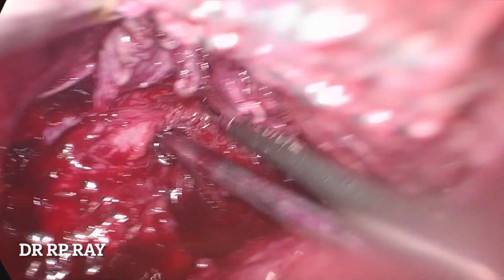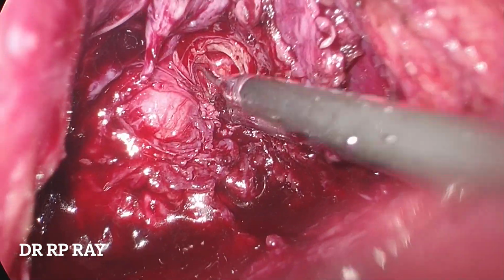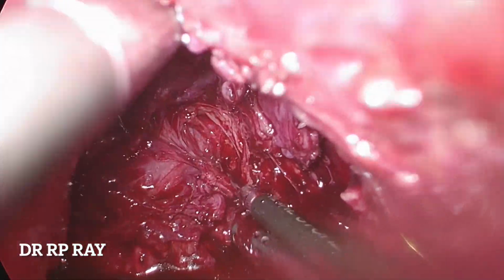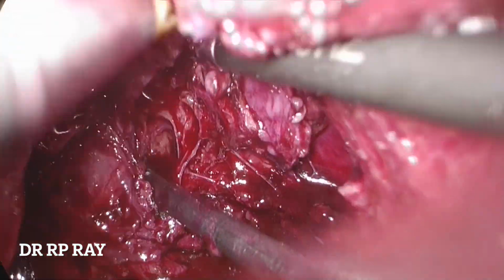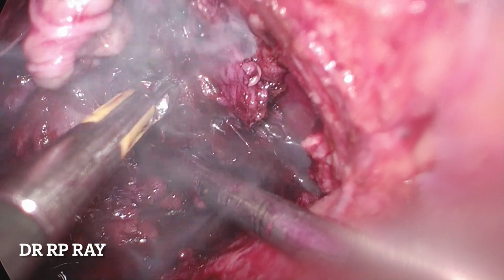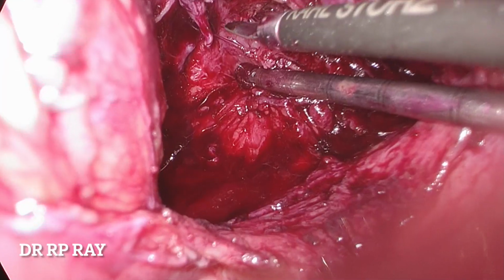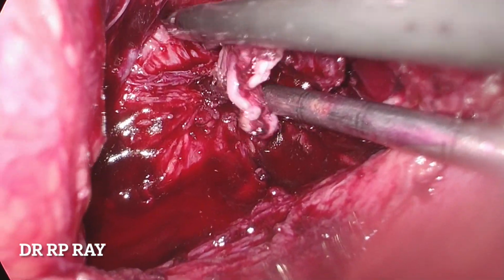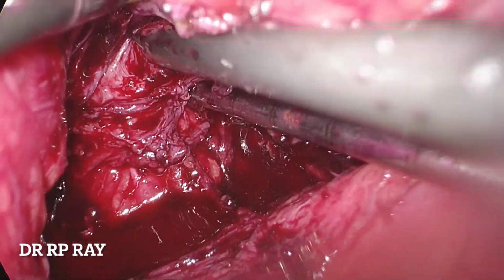In Indian patients we have found that there are a lot of adhesions, maybe because of transrectal biopsy as well. And in Indian patients, the incidence of prostatitis is much more than in Western patients, and that could be the reason we encounter adhesions in most of the patients during the dissection of the posterior aspect of the prostate. From this window, as much as possible, you should continue the dissection as much as you can safely do.